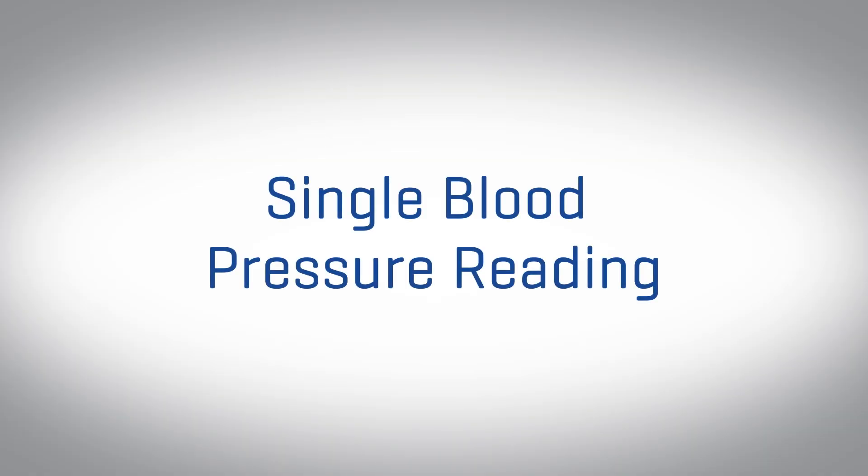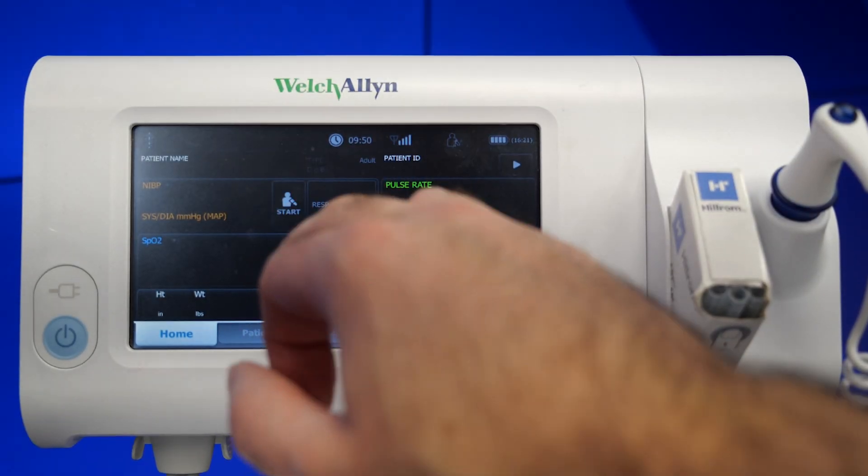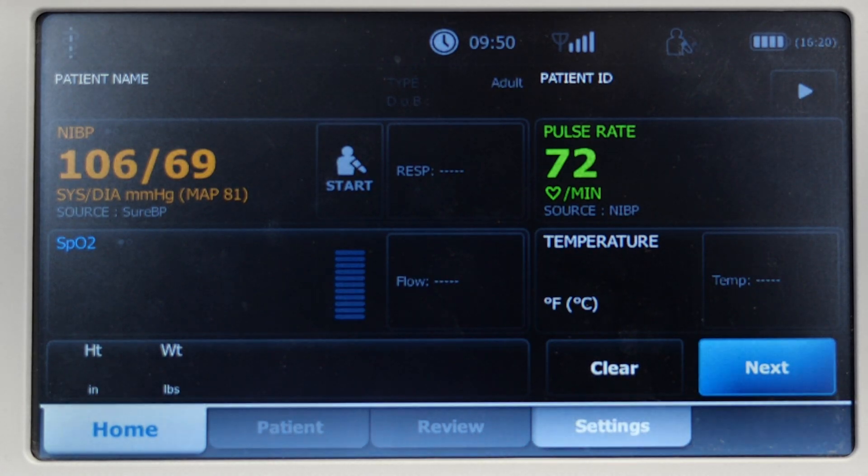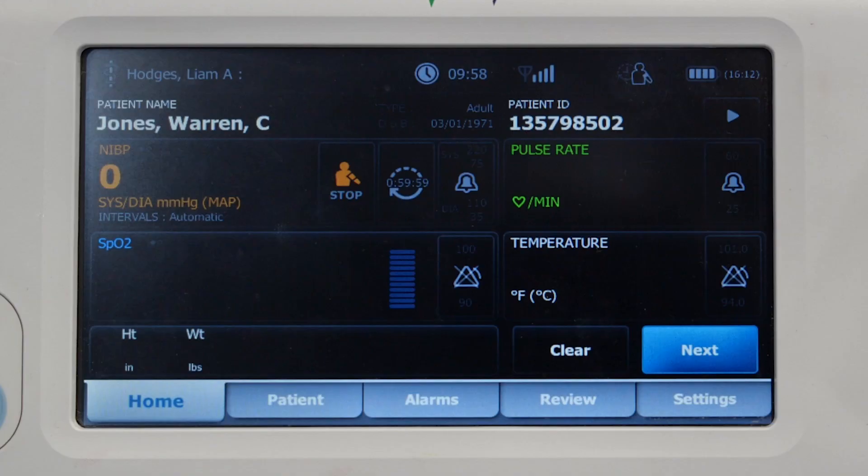To take a singular blood pressure, press the BP start button. When a measurement is started, the monitor inflates the cuff to the appropriate level. In the NIBP frame, the systolic display shows the cuff pressure while the blood pressure measurement is in progress. When the measurement is complete, the monitor displays the final reading. To stop the NIBP during the measurement, simply touch the stop button.